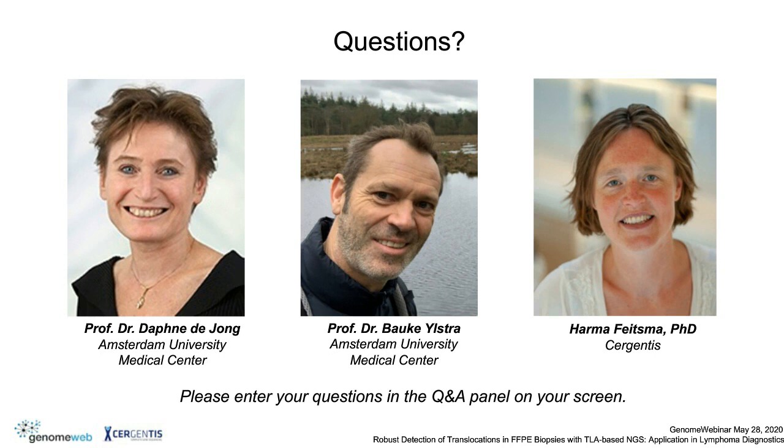Yeah, well, good question, of course. So if you use RNA, you can only work with the transcribed RNAs, and a lot is not transcribed, first of all, and the other thing is only fusion genes that you look at then. And here we have translocations where you have, as I explained before, MYC, that is very often regions which are, for example, promoters or enhancers that are far outside the actual coding gene. So yeah, this would not work for this particular situation.